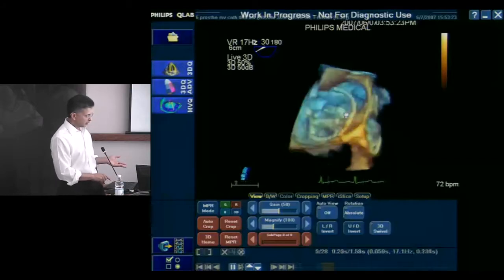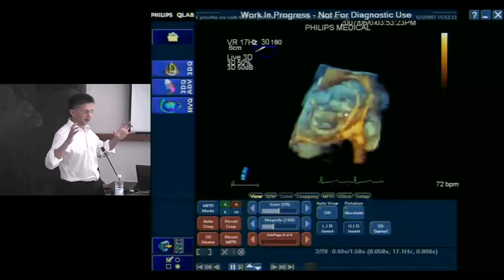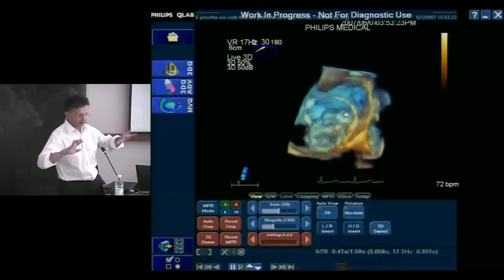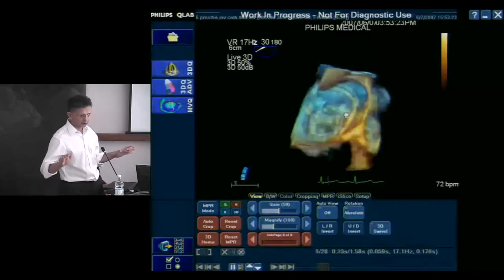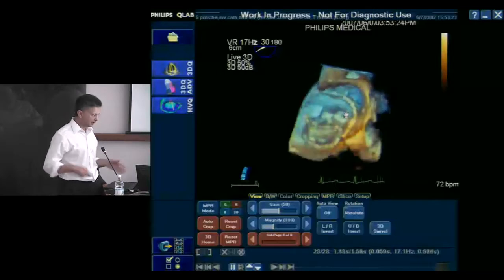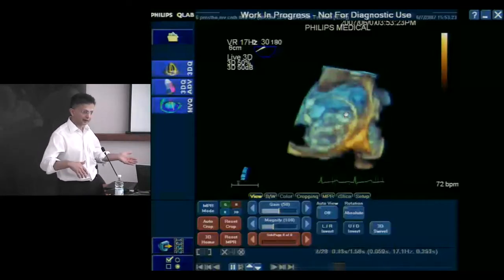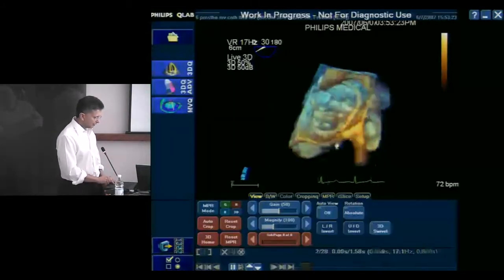And the question here was, is there another problem? Because we could see, as you can imagine, by 2D color flow and all, we were not able to understand anything about how much. There was MR, there was new AV valve leak, and she started hemolyzing again. So there was no question there was a problem. She was not a surgical candidate because she's had too many other things going on. And so the interventionalist decided to go in and see if there was another paravalvular leak that could be closed with a device.